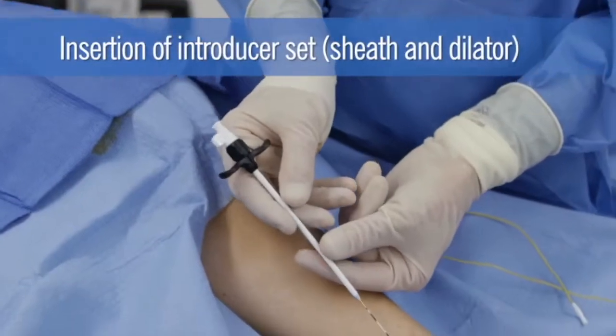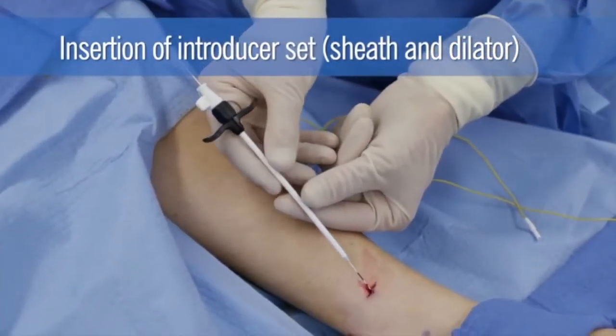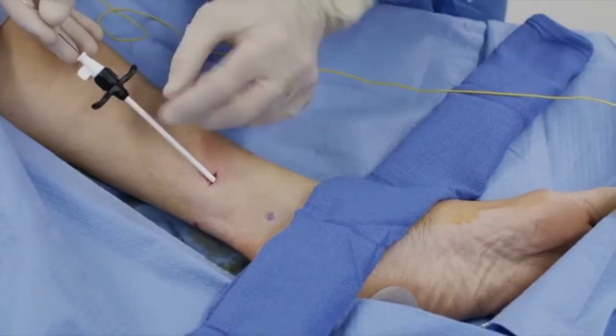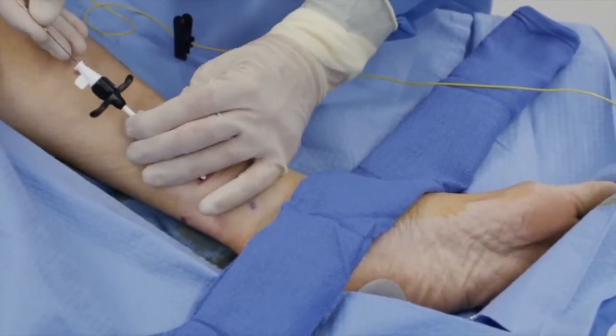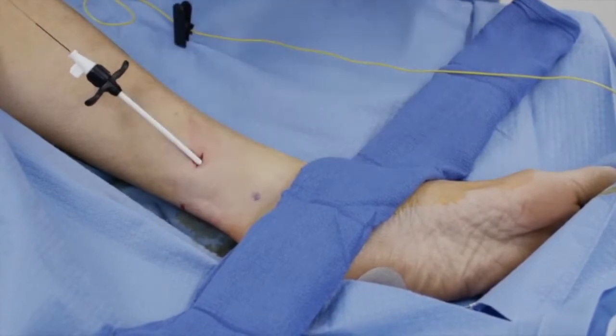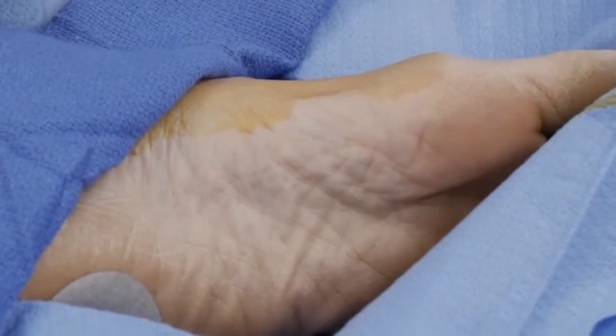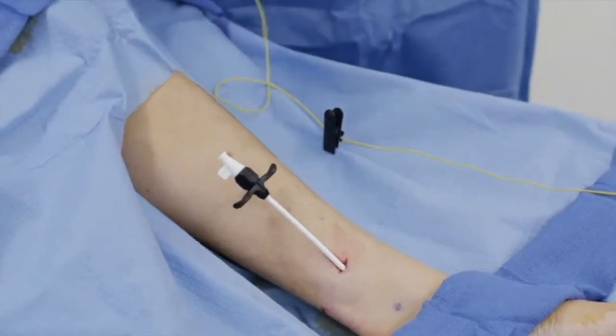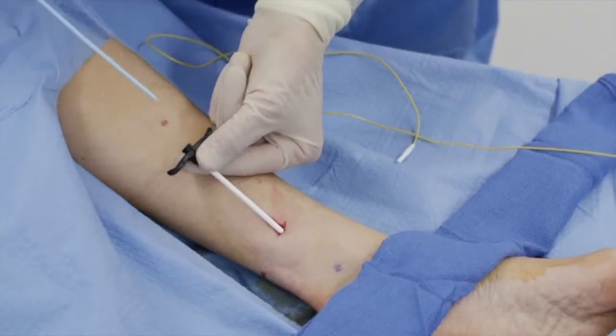The introducer set, which includes the sheath and dilator, is then positioned to the tip of the stimulation probe. This is at the transition from the proximal black marking on the stimulation probe to the copper portion. Stimulation at this positioning confirms muscle twitching. The dilator and test probe are then removed, leaving the introducer sheath in place.